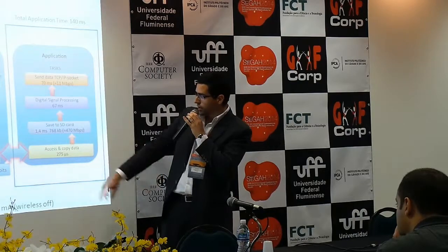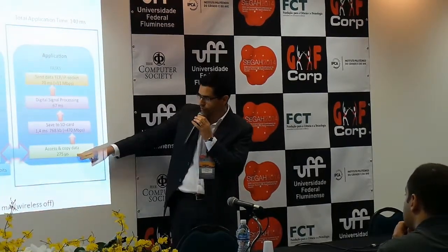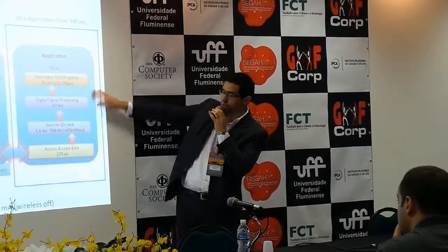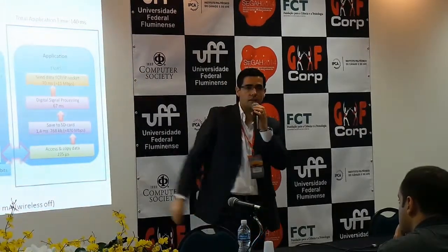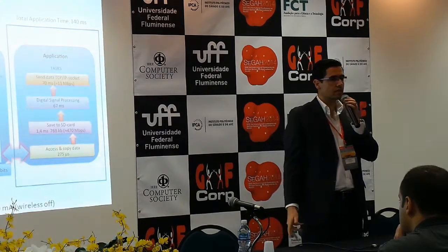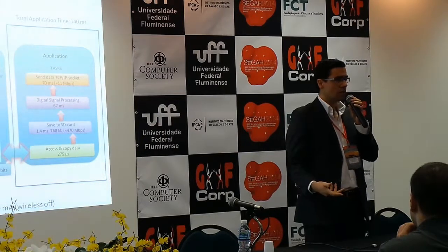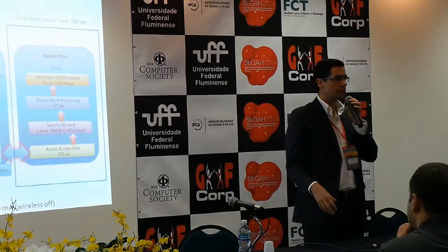122 microseconds to copy the data to the second buffer. Then these are the times for each part of the processing. You can see that those are very small times. In the end, the total time for the application is 140 milliseconds out of 1 second, which means that we spend less than 20% of the time with the acquisition, processing, and transmission.